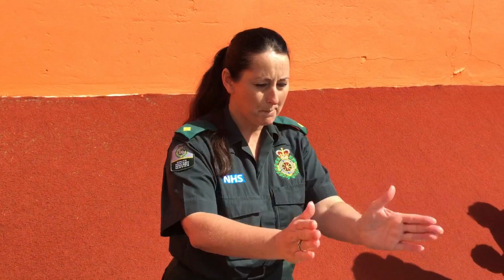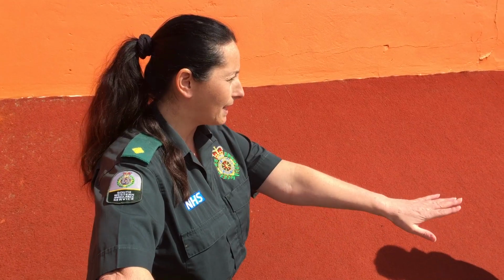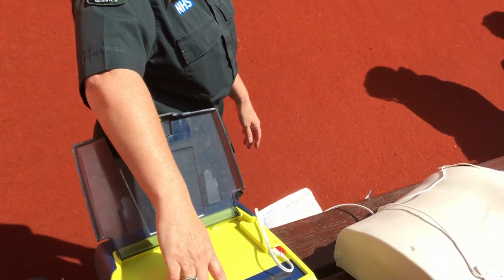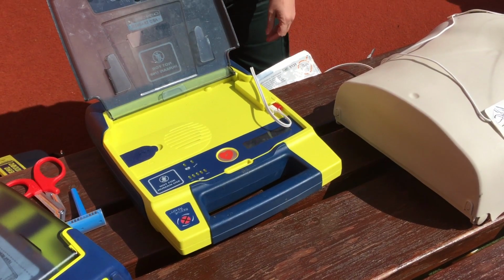Clear, checking top, middle, bottom. Just before you hit that shock button, you're checking again, no one's touching the patient. Shocking. Shock delivered. It is now safe to touch the patient.